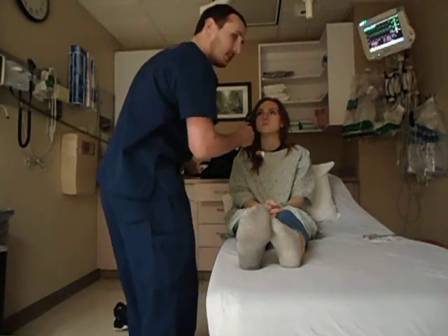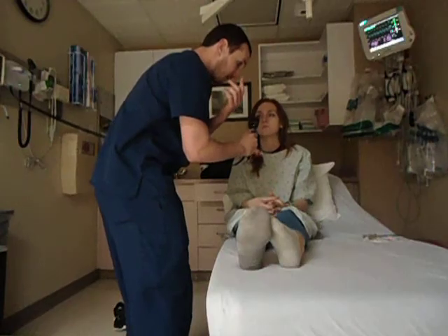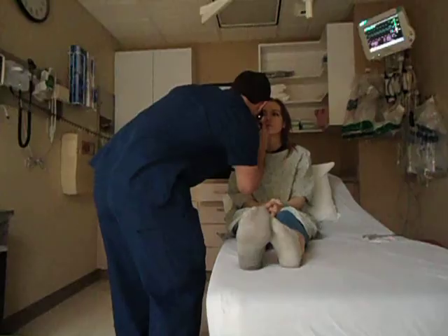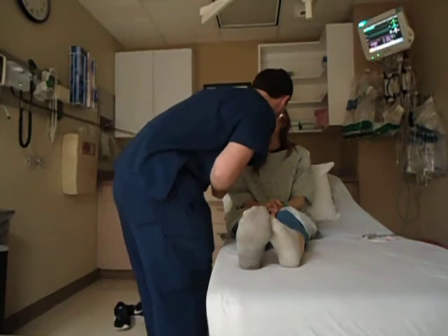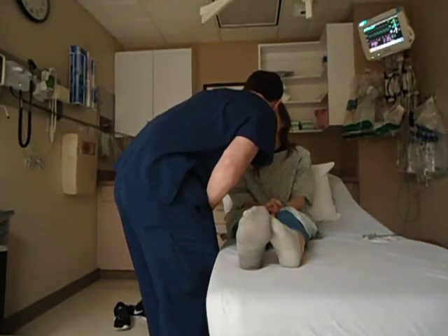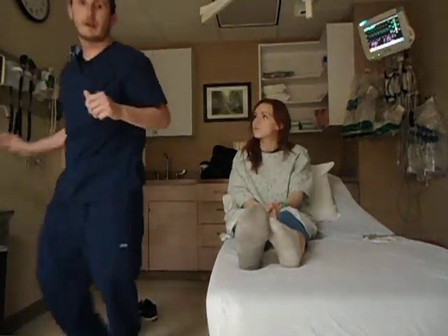So I'm going to go ahead and look into her eyes now and check out the back of her eye, for her optic nerve and her macula back there. So she does have a positive red light reflex.